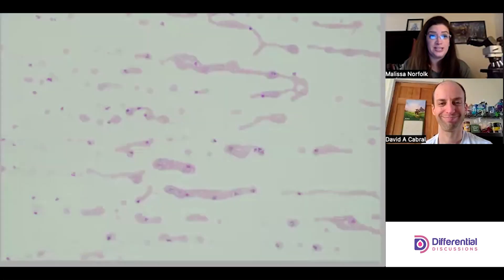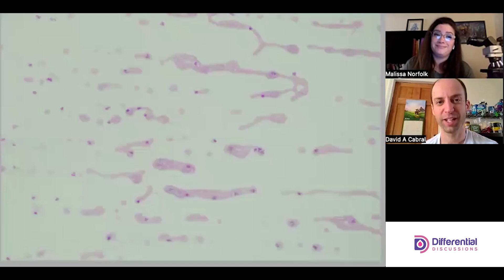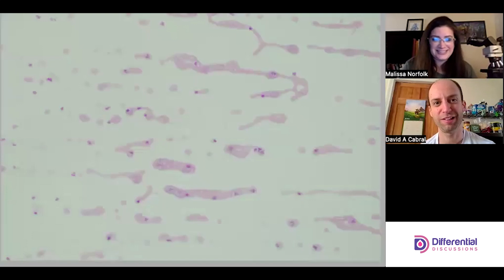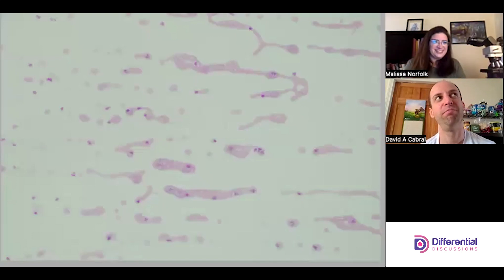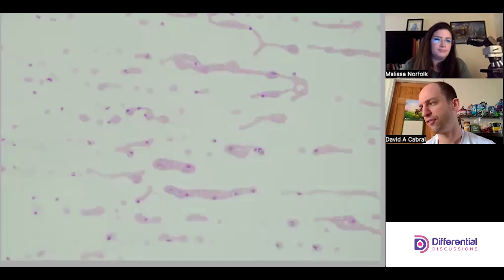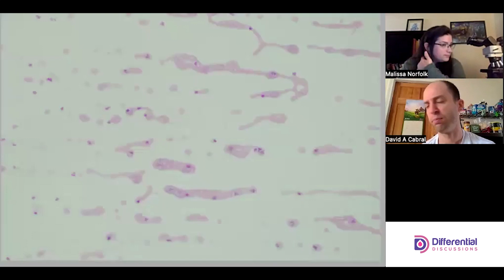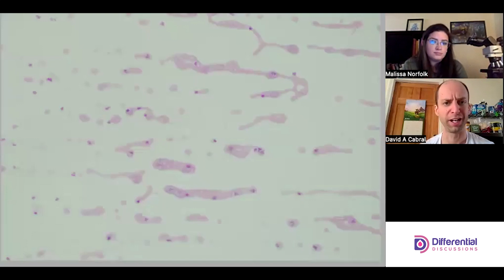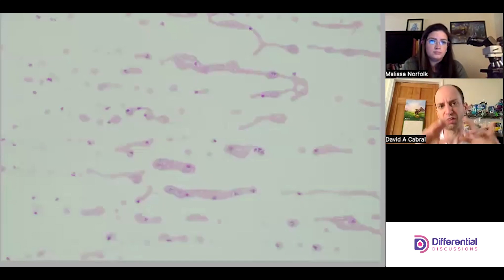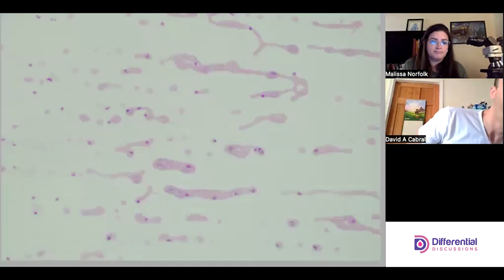Hello and welcome to Differential Discussions. I'm Melissa and I'm Dave. Today we're going to look at a slide that has platelet clumps. Working at the bench, you'd probably have a platelet clump flag or something to that effect, and you might observe that your platelet histogram looks weird — maybe it has a shoulder, it's bumpy, or there's not much of a platelet histogram.